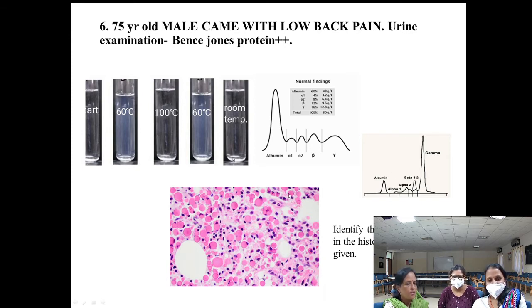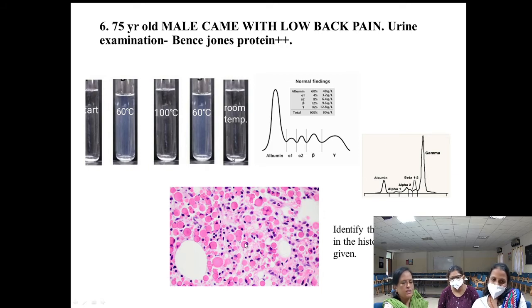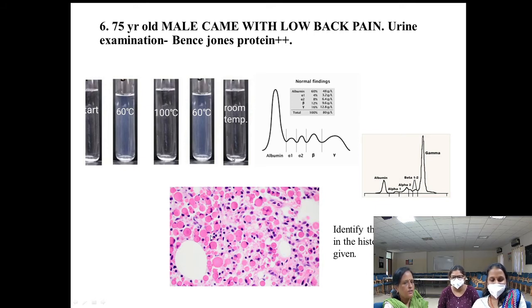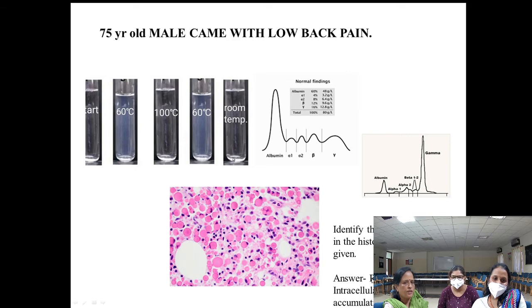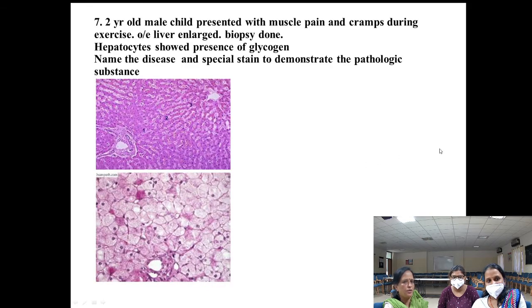This case was used as an example of intracellular hyaline change. Plasma cells produce immunoglobulins; when immunoglobulins accumulate within the plasma cell, they push the nucleus to the periphery — forming Russell bodies. Russell bodies can be extruded and seen extracellularly as well. This illustrates intracellular accumulation and hyaline change.